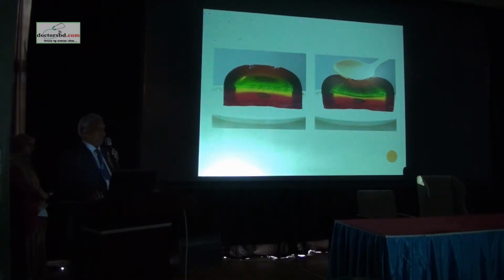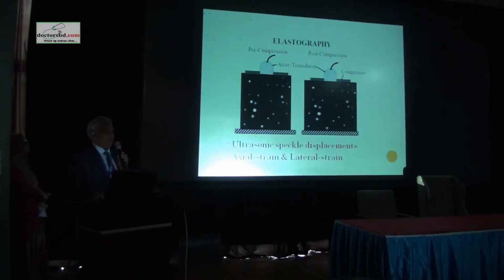Look at this example, you can understand it very well. See the two models. One model is without any pressure. In the other model, when you apply pressure, you find a little bit of deformation. But there is some area, represented by the almond, representing a hard tissue, which does not deform. That is what happens in response to disease when elastography is applied.